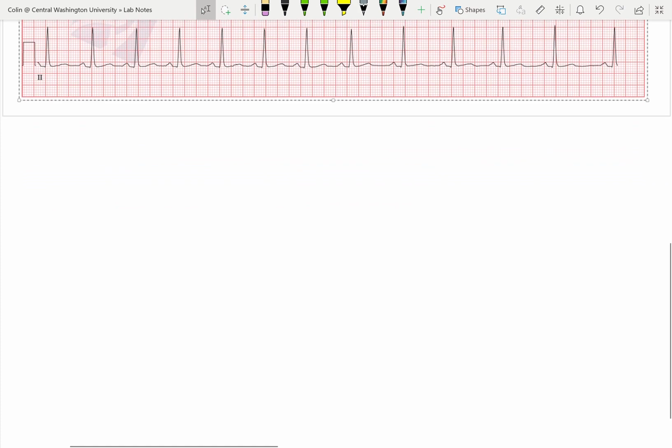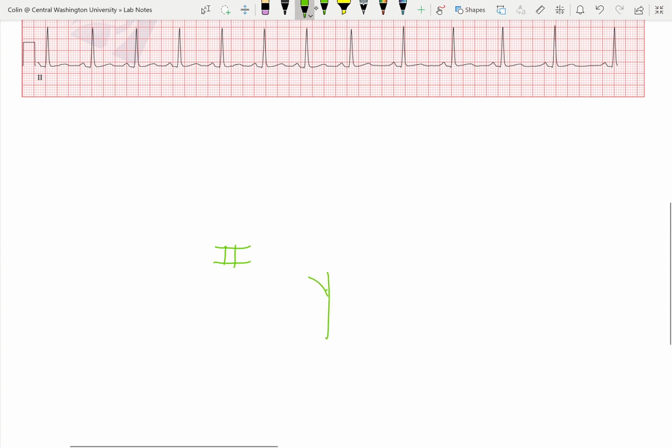So the leads themselves, those stickers that you're placing on the patient, have both a negative and a positive. Okay. So if we have lead 2, and we've got the sticker on the person, it's looking, so if the person's right here, I know, super, super nice, right?